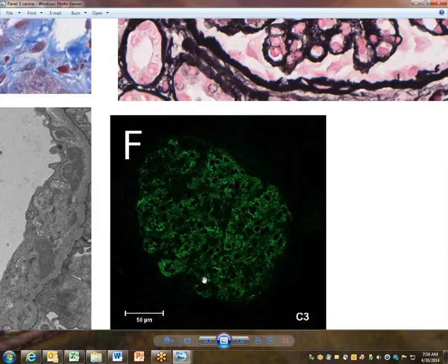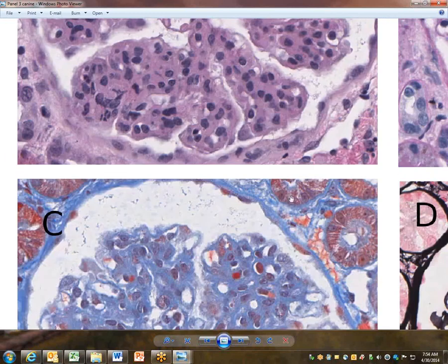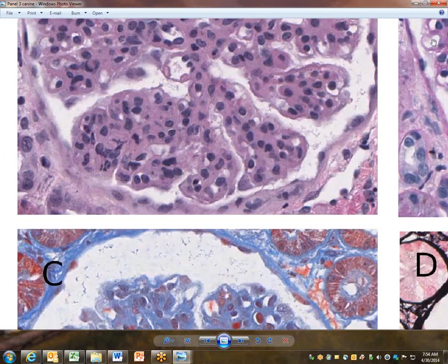And in the interest of time, we're going to head to the PowerPoint, George. All right. There's some nuclear debris and things there that we would focus on some other day.